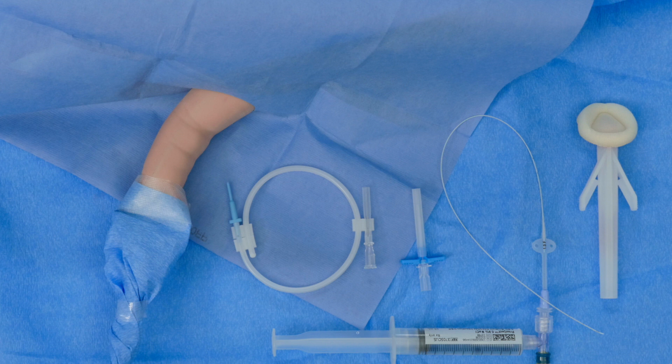Welcome to the Neomedical instructional video for the modified Seldinger technique for insertion of vascular access devices in the neonate, infant, or small pediatric patient. Modified Seldinger technique is commonly referred to as MST.